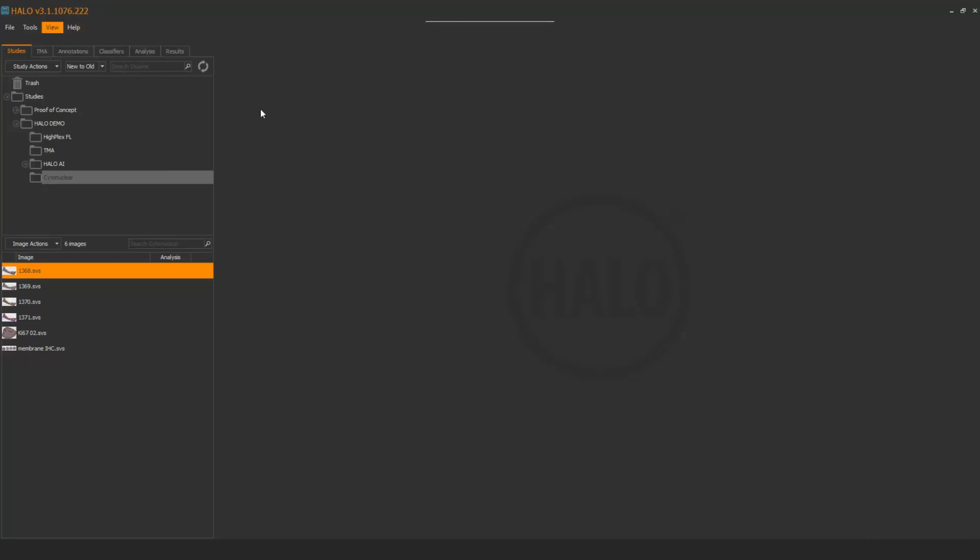So here we've got orange and grey color scheme, and this would be probably more suitable for viewing of fluorescent images, where the contrast between a dark background and a dark GUI would be easier on the eye than if you were using the lighter skin. Most people would use this skin for the bright field images.